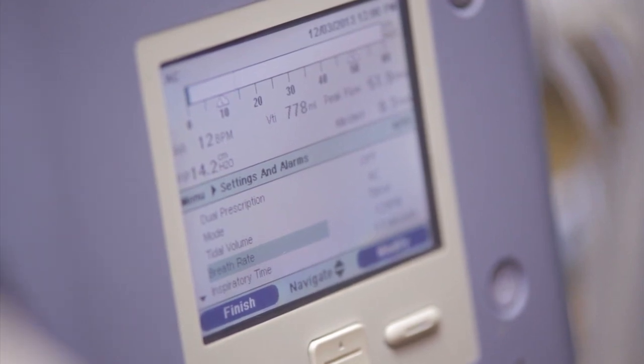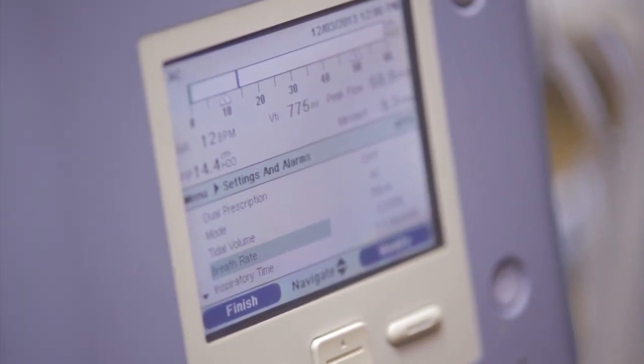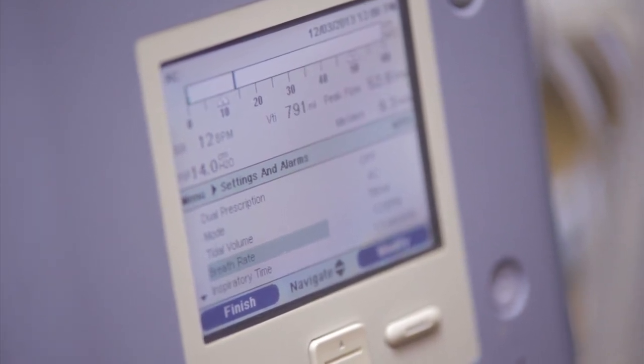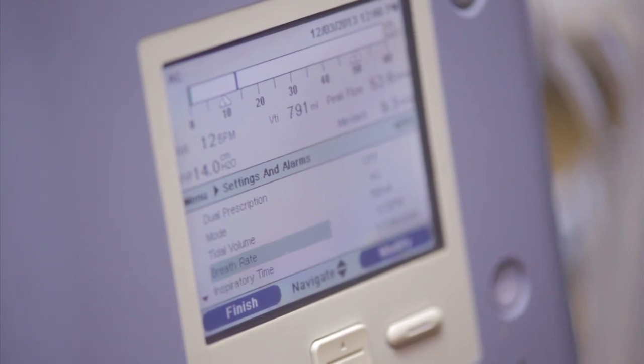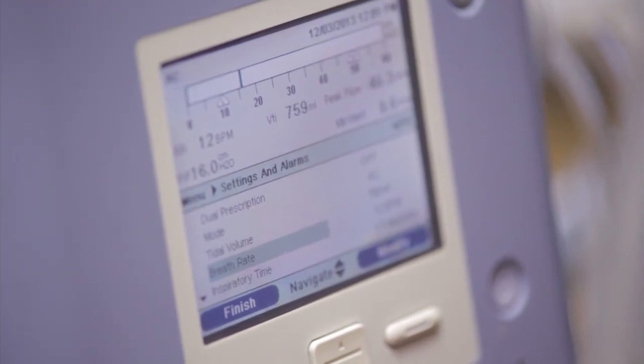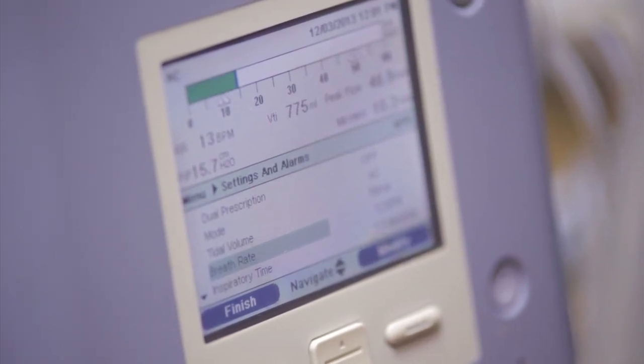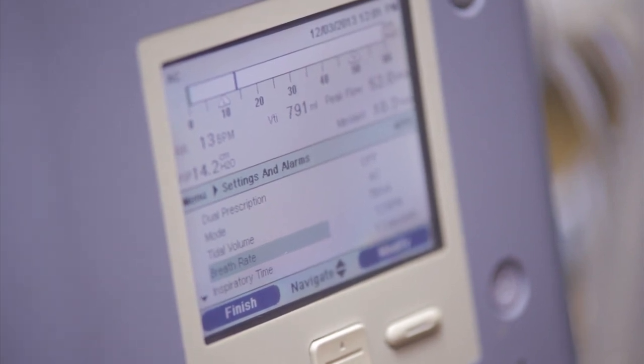Do you feel comfortable? So I can go to karaoke? You can go to karaoke and sing to your heart's content — you might even get into a barbershop quartet if you wanted to. Can you harmonize, you think? I would make a recommendation to the doctor that we increase your tidal volume by about 30 milliliters to make sure we overcome and keep your lungs open, so we don't have any atelectasis at the bases.